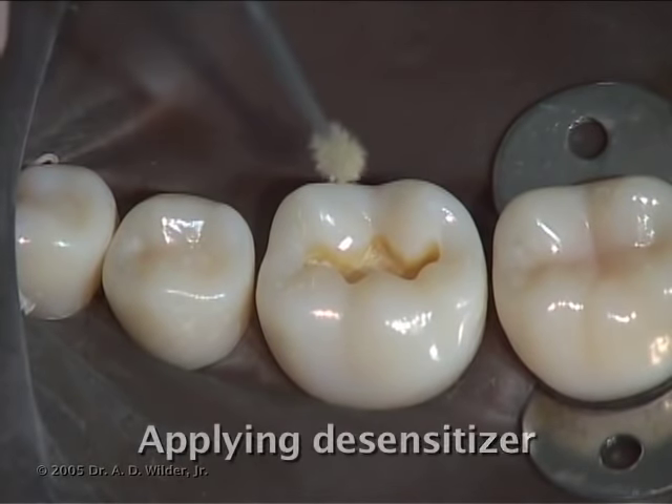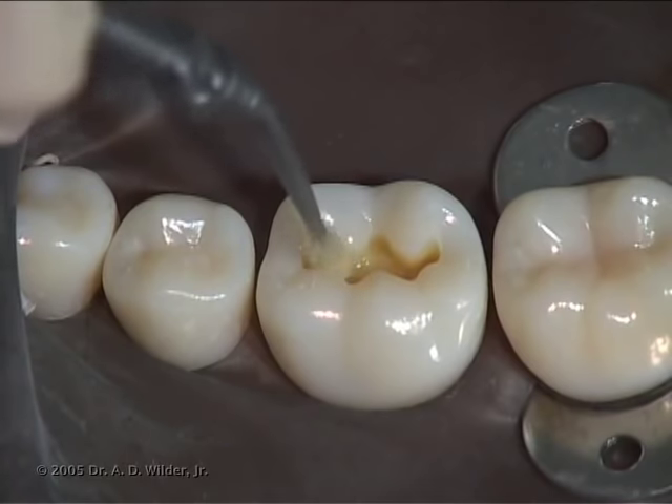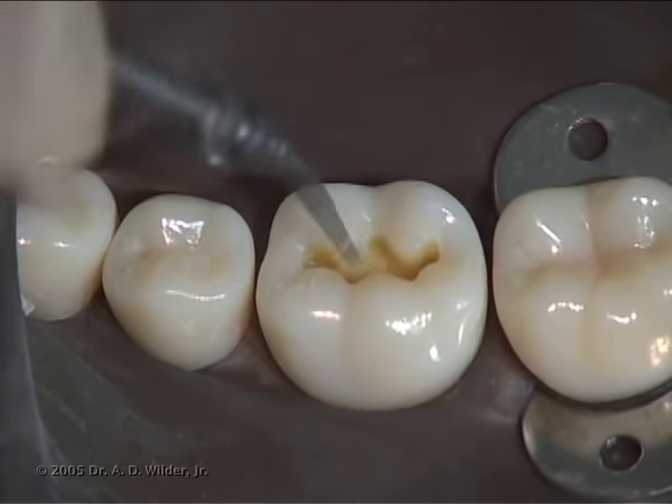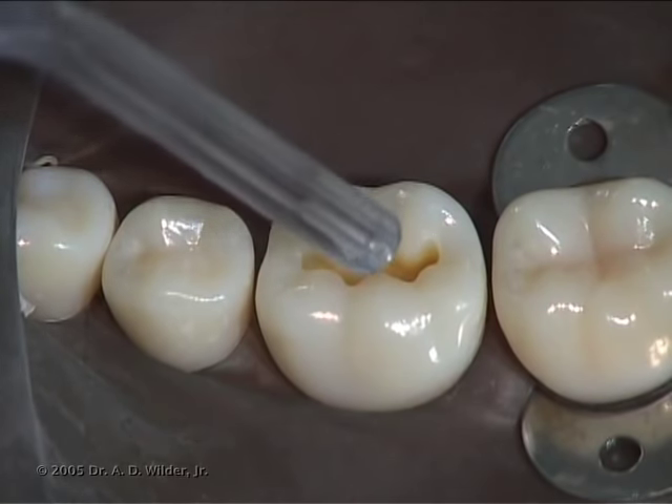Apply gluma desensitizer with a micro brush and rub it into the dentin for about 30 seconds. Then dry with a light air spray to evaporate the solvent.